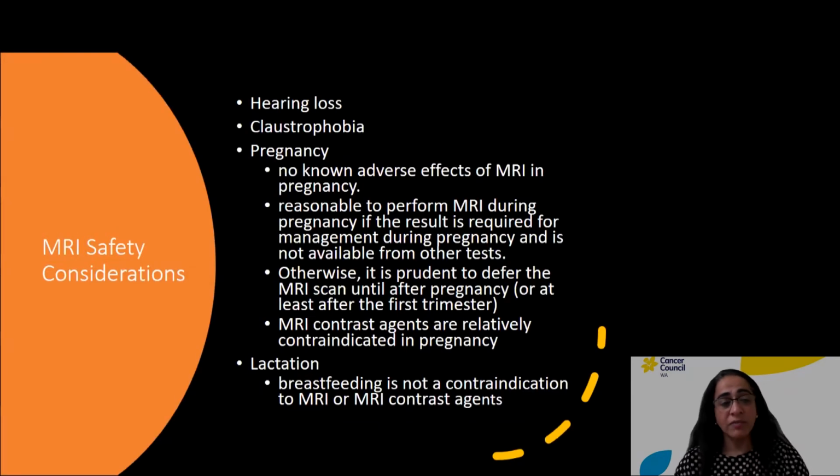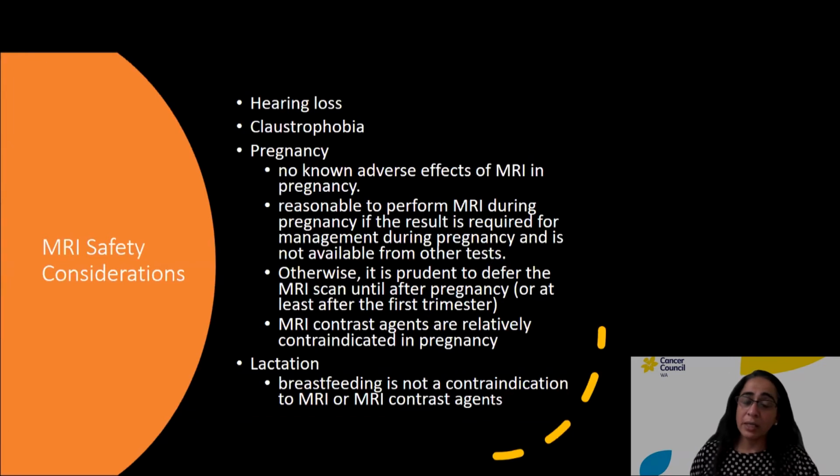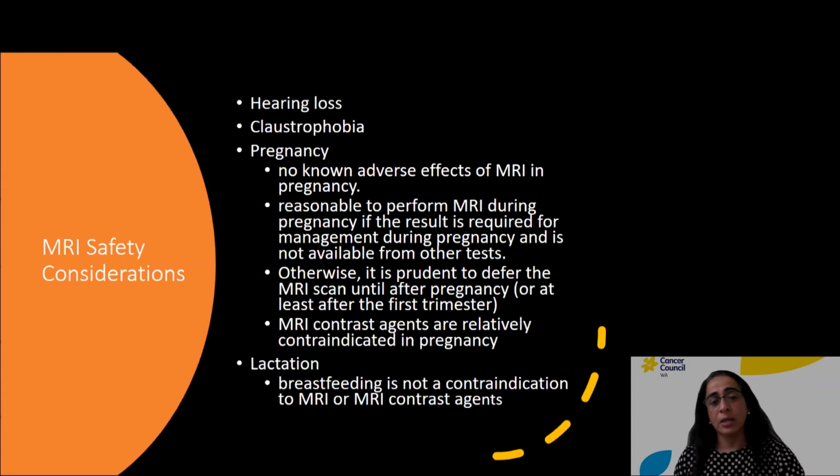And one needs to carefully consider MRI in patients who have hearing loss, because there's a loud clicking noise that can actually exacerbate a person's hearing loss, although they are given hearing protection, but sometimes that doesn't prevent the hearing loss from happening. Claustrophobia is another issue. Some patients do not handle lying in the bore of the MRI scanner.